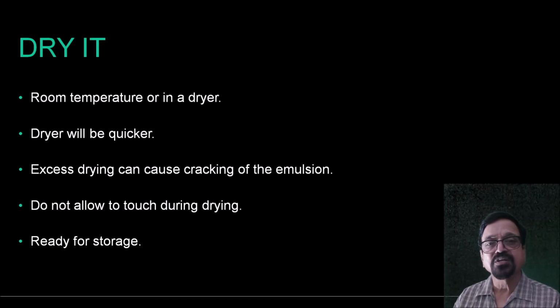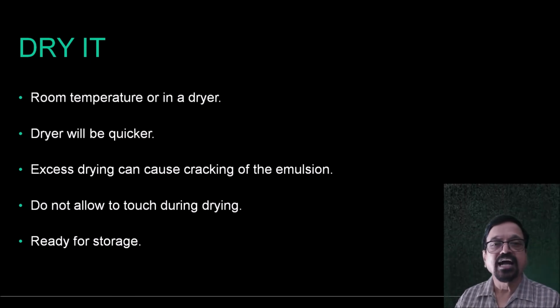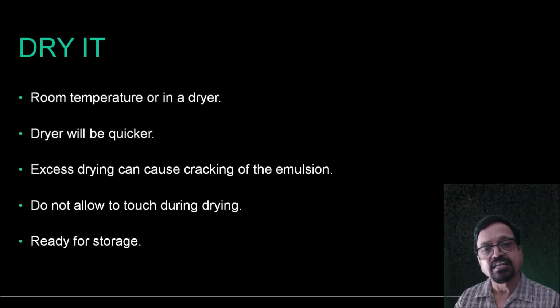The film is never touched while drying. We can make out by looking at the film whether it is dry or wet. There is no need to touch it. And if you touch it, there will be an artifact or fingerprints over it. And then only properly dried film is useful for storage.